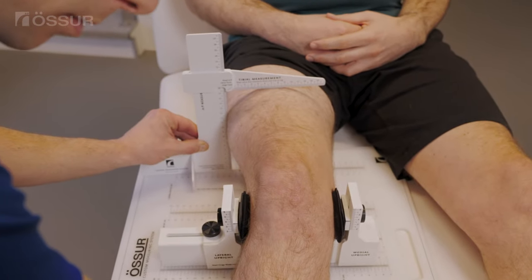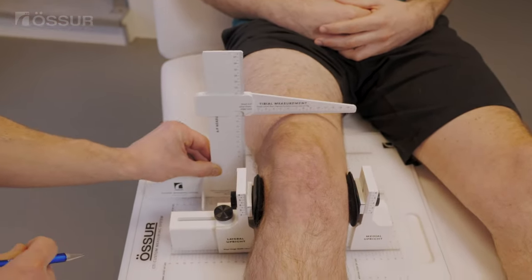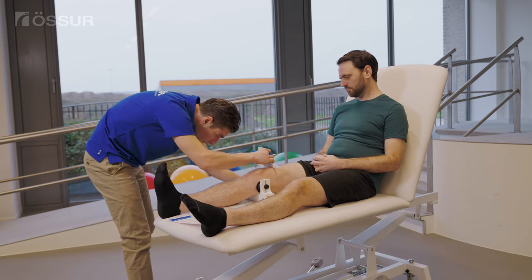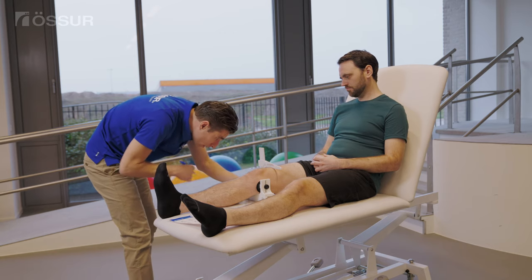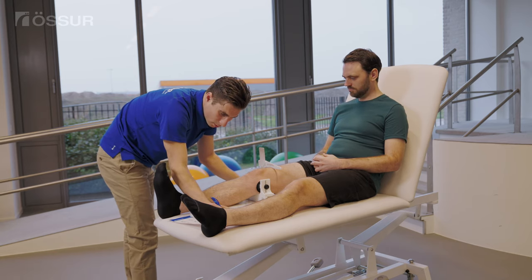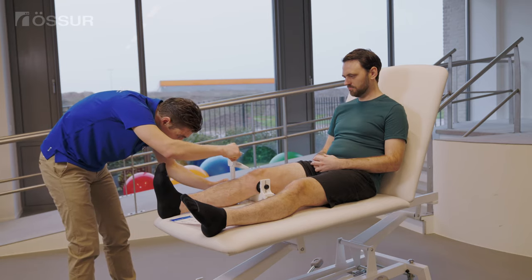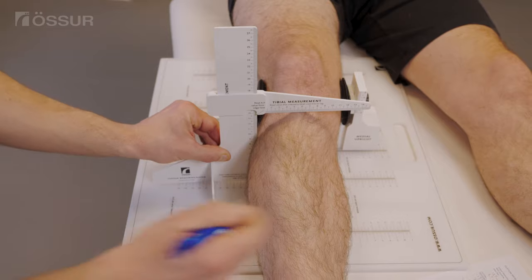The custom measurement system requires you to use the CMS jig, constant force calipers, and a soft measuring tape. Make sure the patient's foot is dorsiflexed throughout the lateral measurements and recording process. You will need to collect and document all 23 measurements to ensure the brace fits accurately.